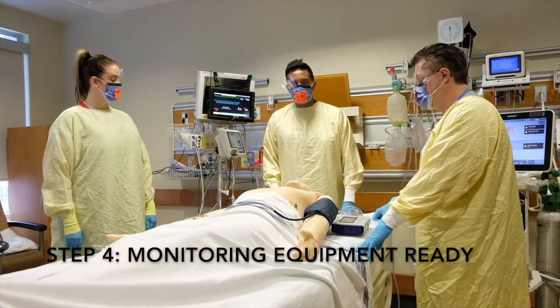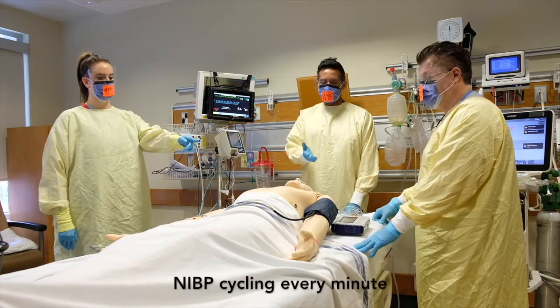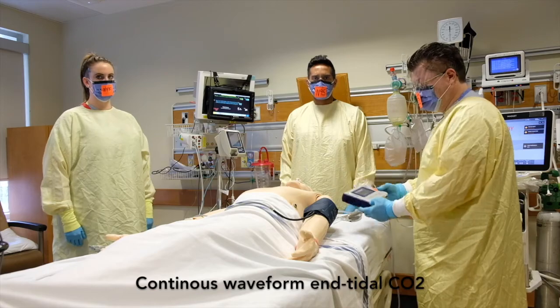So the next step is to ensure that we have all our monitoring equipment ready. The first is to have NIBP cycling every minute, as well as on the arm. We have a pulse ox on the opposite arm, and we have end-tidal CO2 continuous waveform.